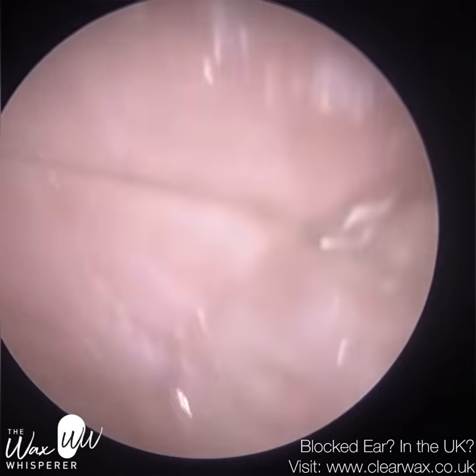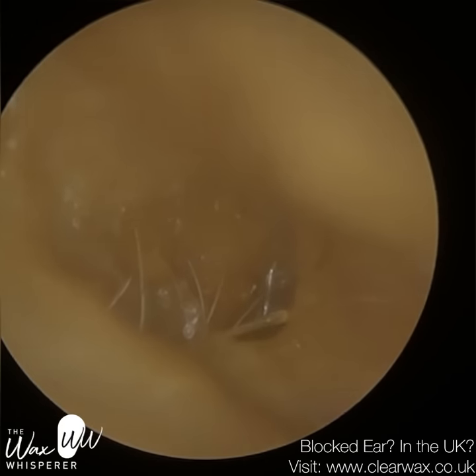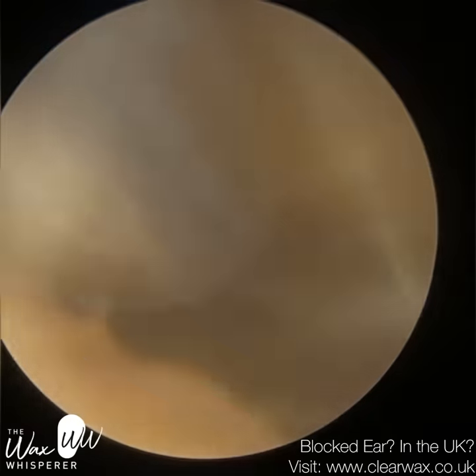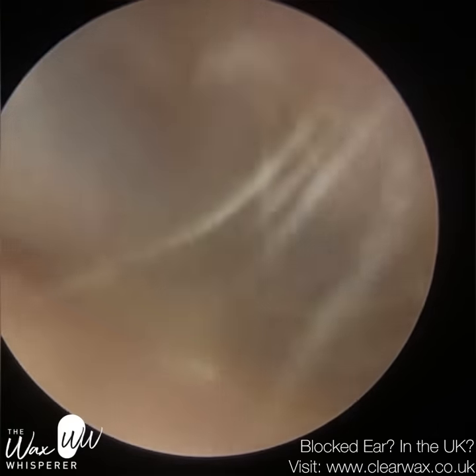In the past I've compared it to mashed potatoes, as you can probably see — I enjoy my food analogies. However, I think a better description of this is lard or soft butter, and it's just compacted in the ear.